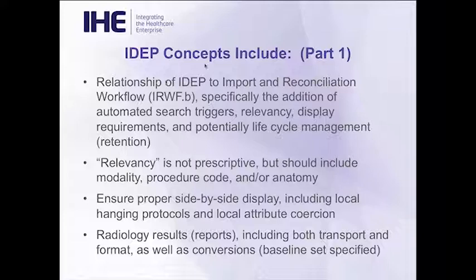Relevancy in this profile isn't something that we prescribe to say this is what defines a relevant study, because it's something that we don't feel that the IHE Radiology Technical Committee should be doing. We give some ideas for data elements that we think should be used in determining relevancy, but that is something outside the scope of the profile, and in fact, it's something that a product will be able to use to differentiate themselves from other products and say, our rules are more flexible to let you define what your institution believes to be relevant. So the word relevant is not defined precisely within this document. We have no intentions of trying.